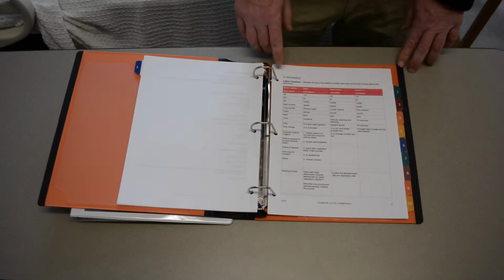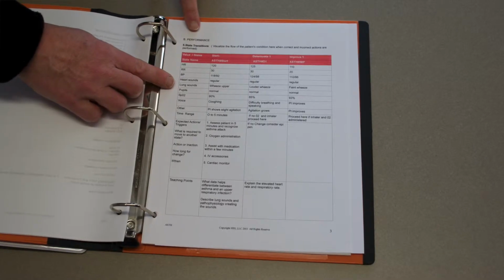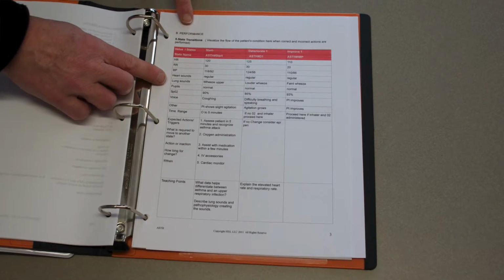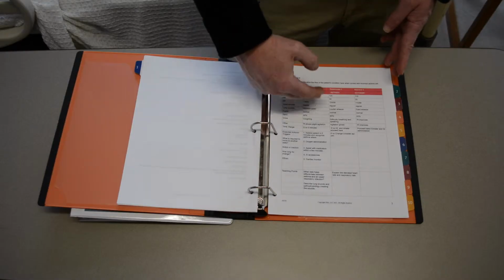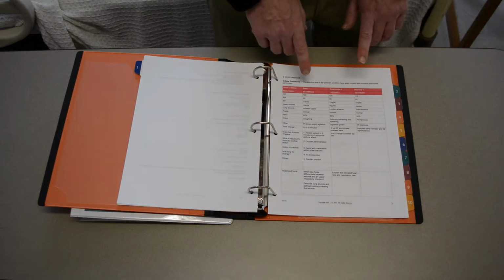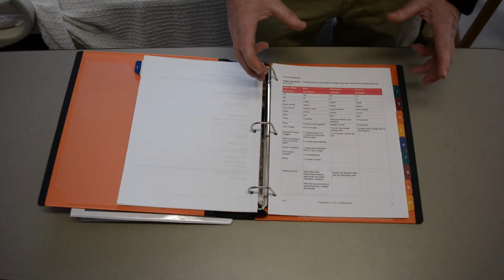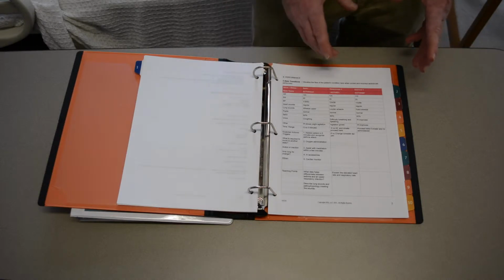The second part of the scenario system is the performance component. This is where we will be now running the scenario, and these are the instructions for the operator on how to run the scenario. Scenarios are set up where all the physiology that is programmed is laid out, and we operate with the concept of patient states, meaning a collection of vital signs at one time.